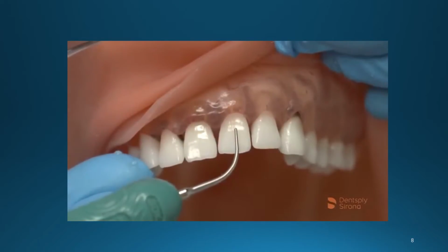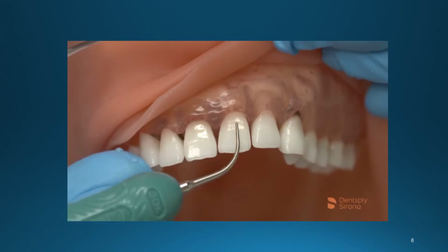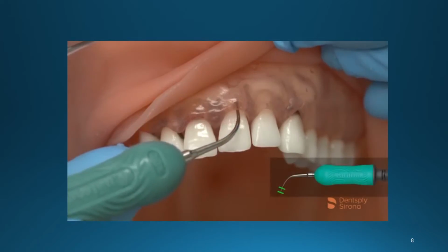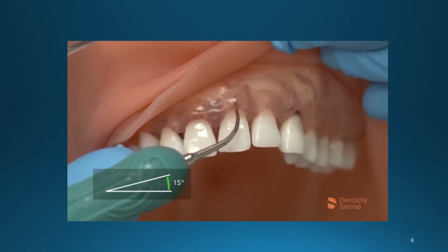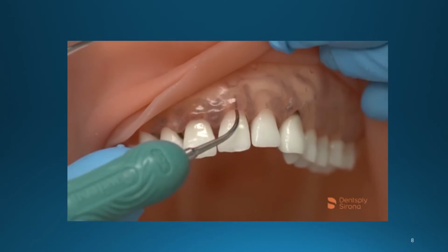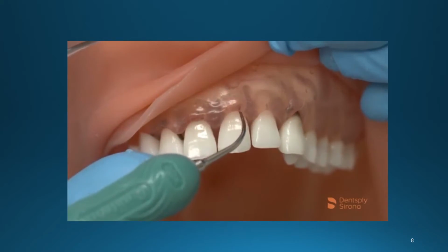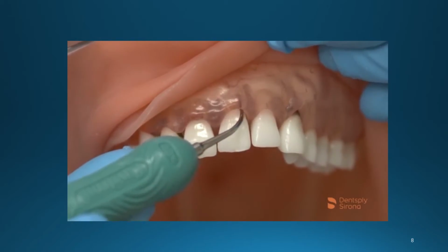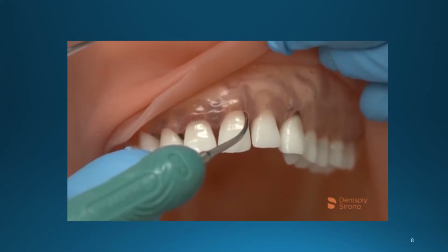The clinician will adapt either the lateral or back surface of the Cavitron FSI Slimline 10 to the clinical crown and float towards the gingival margin, maintaining 2 to 3 millimeters of adaptation and a 0 to 15 degree angulation. Depending on the patient presentation, the clinician will enter the sulcus or pocket in either a vertical or transverse approach. For demonstration purposes, we are utilizing the vertical approach for the patient with deeper periodontal pockets.